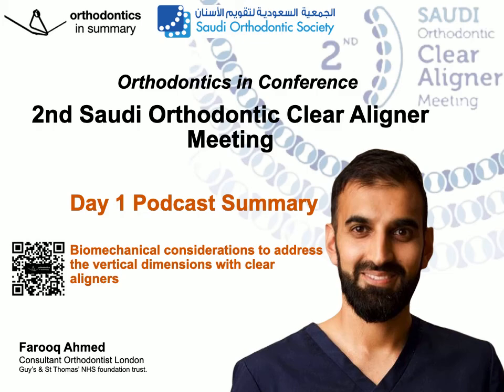So to describe this, we're not talking about attachments on the palatal, on the labial face, on the lingual face, actually on the occlusal surface. This allows an excess of plastic there, so the patient, when they are occluding, are intruding the teeth on the attachment. A way to encourage this is for the patient to wear short class 2 elastics, between the 3 and 4, for example, from upper to lower, helping to force occlusion together. Finally, he described posterior intrusion, although it's favourable for aligner mechanics, can be unpredictable, and actually for anterior open bite cases, we're more likely to have anterior extrusion.